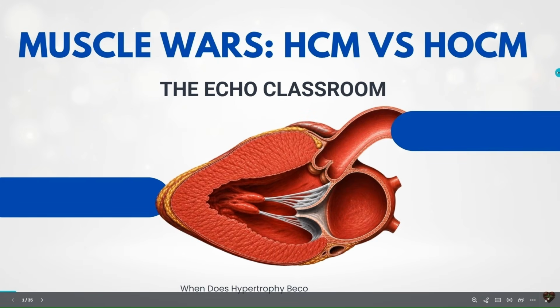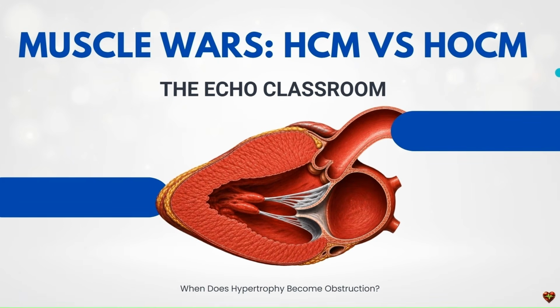Welcome back to the Echo Classroom. Today we have a battle of the muscles, HCM versus HOCM. They may look similar, but only one brings obstruction to the fight. Let's get into it.